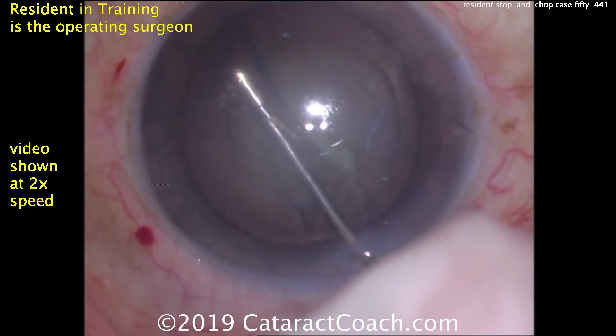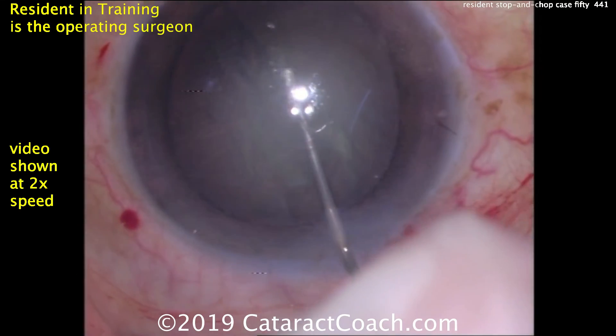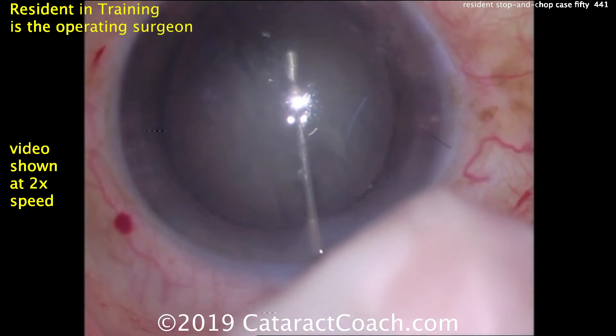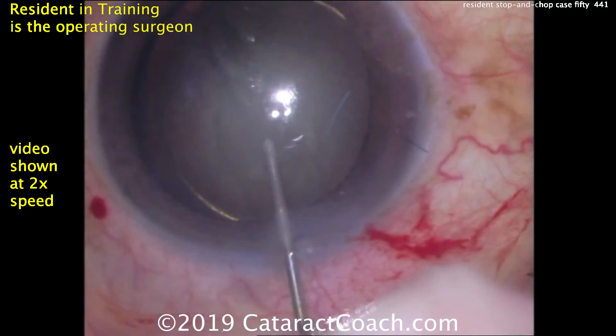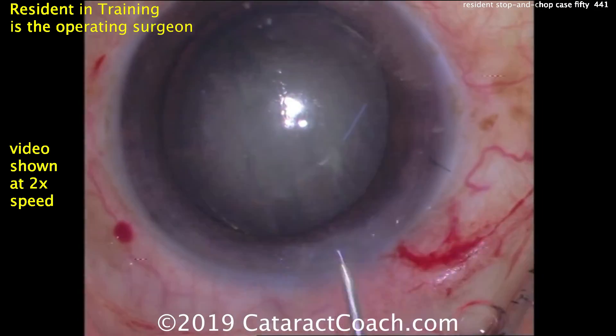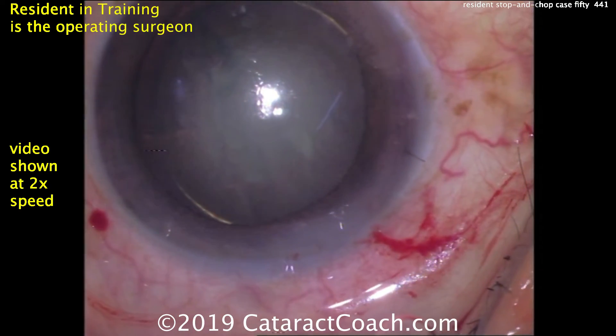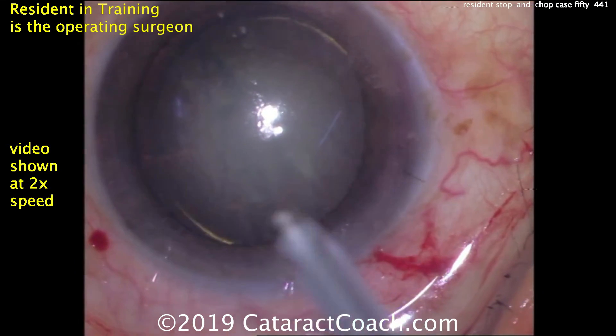Good fluid wave goes through — I like that very much. There's the whole nucleus, nice and loose in the capsular bag. That looks pretty good. You can see the golden ring of hydrodelineation as well. This is a nucleus that's really nicely freed up from the capsular bag.